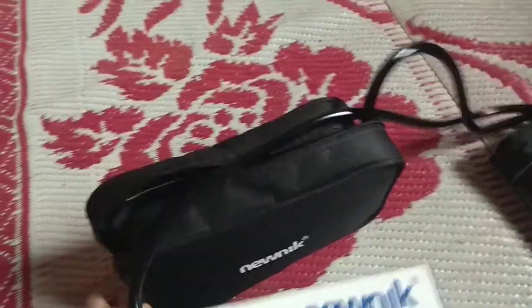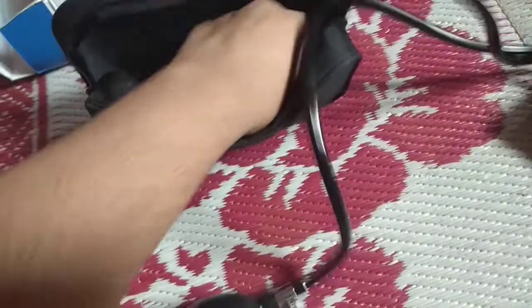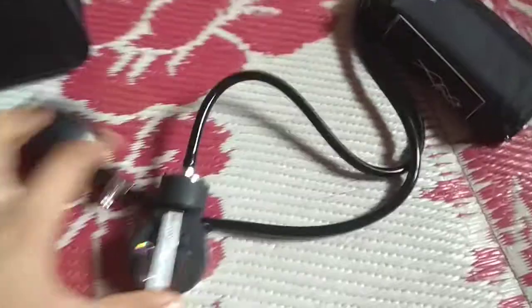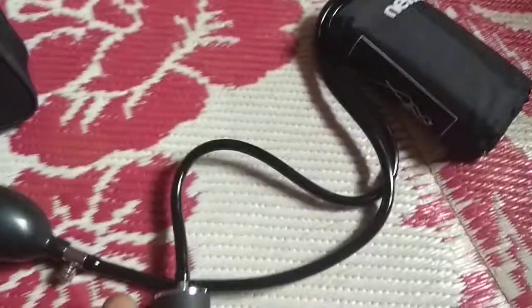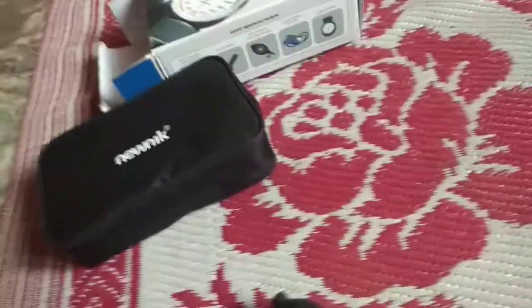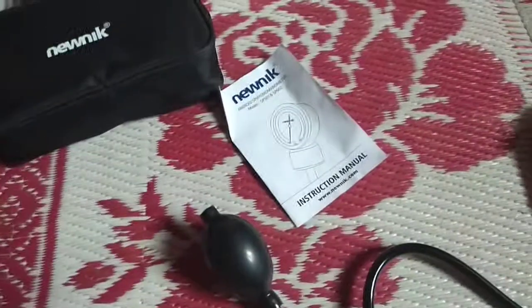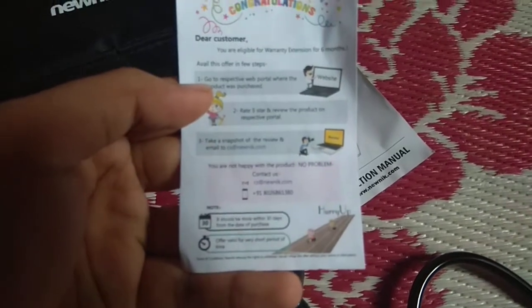So I have used this for at least 2-3 days. And you will get a Spigma Manometer with the user manual.